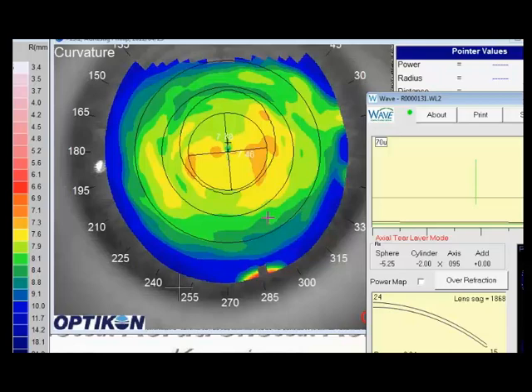Another way you can tell is if you have your initial lens and you find that cylinder over-refraction, remove the lens, dot the lens, and then put it back on the eye, and check that dot for stability. If the dot moves around, then you know you're going to need prism. If the dot stays stable, then chances are you will not need prism.